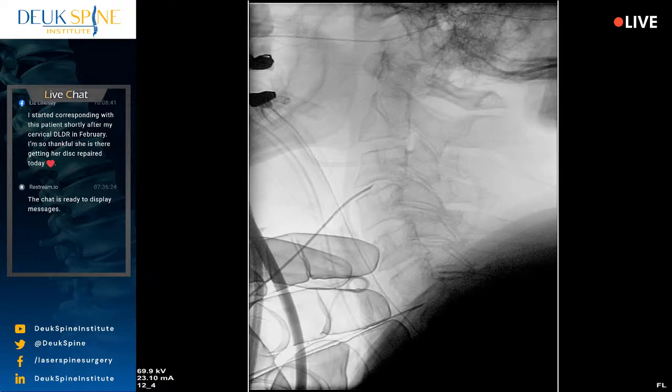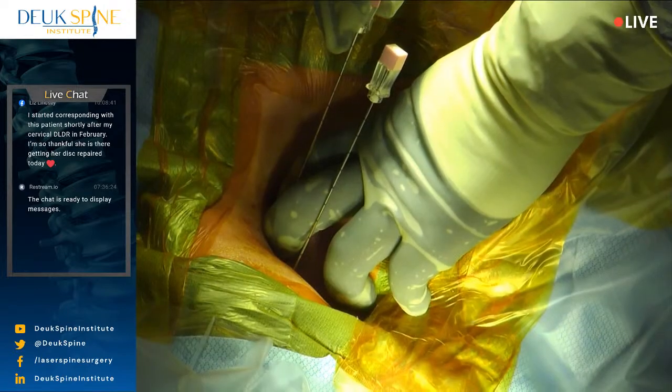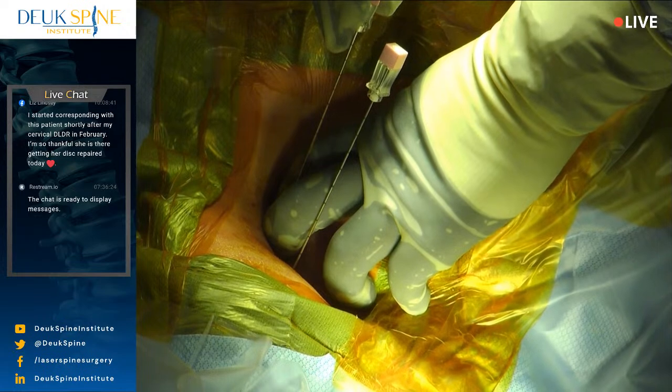Now, give me an AP. I think we're off to the side. No. You cannot release. Shot. Yeah, we're off to the side. Back to a lateral. Ling, are you pulling, right? Yeah. All right.